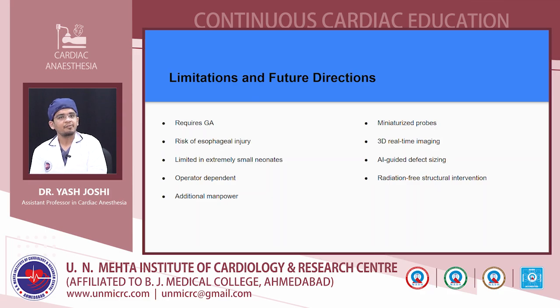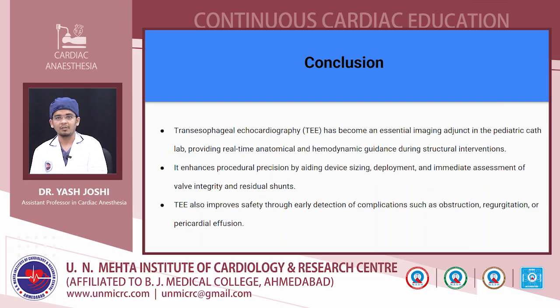There are certain limitations: it requires GA, there is a risk of esophageal injury, and it is limited in extremely small children and neonates, where it is very difficult to even insert the probe. It is operator dependent as well as needs additional manpower. There are certain future directions for the use of TE in the cath lab, like invention of miniature probes, routine and easy availability of 3D TE probes, real-time imaging, AI-guided defect sizing, and radiation-free structural intervention.